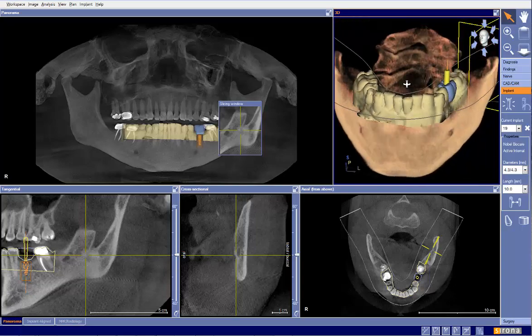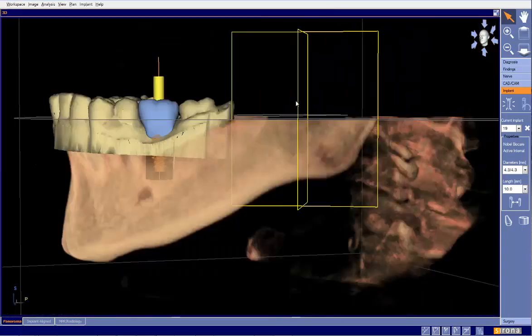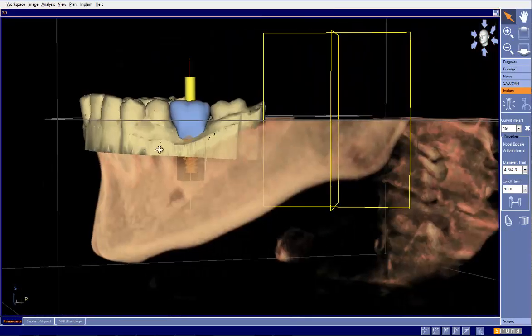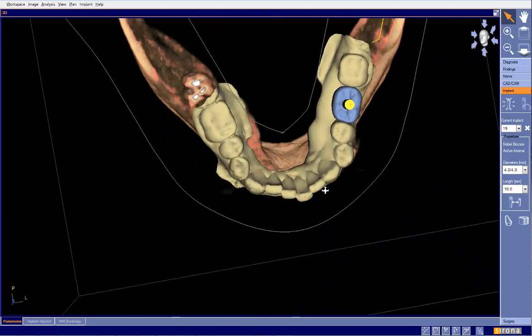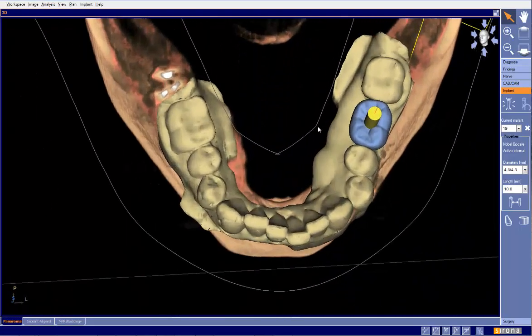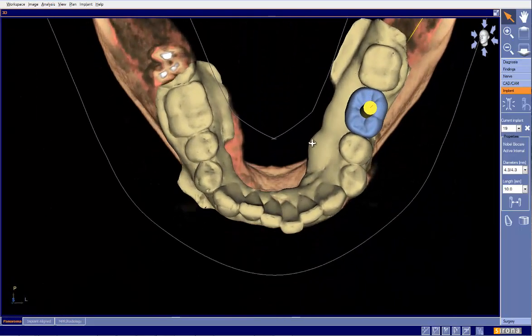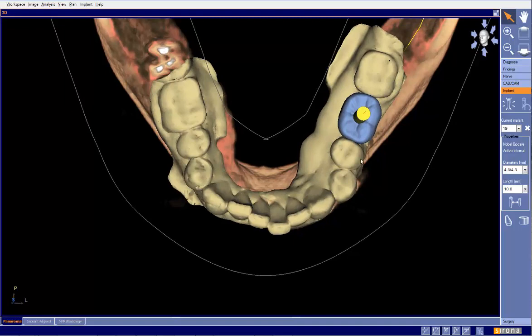Now, the first thing I'm going to evaluate is my CEREC design. Looking at this, we can see the design looks pretty good. The buccal contour follows very well. The lingual contour follows pretty well. If I were being hypercritical, I could say the lingual contour is a little bit thick on this tooth, but that doesn't make that big of a difference here.